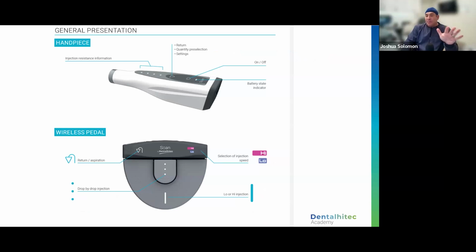Instructions. Please, please, please, if you have a SOAN or you have the Sleeper One, please go through and read the instructions, especially if you need to change some settings. So I wanted to quickly go over tonight the most common settings that people are going to change, okay? Number one, here's the unit itself, and then we have the pedal, okay? This pedal is used when you step on the button, it's not recharged at all.